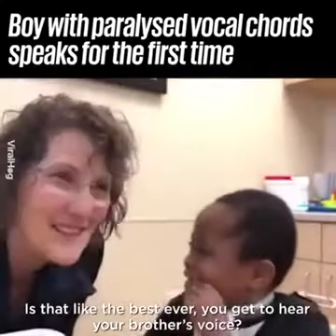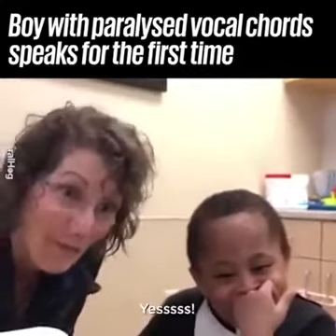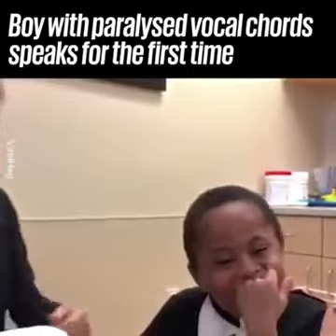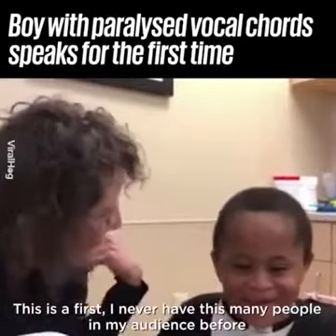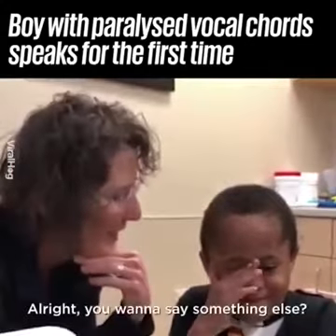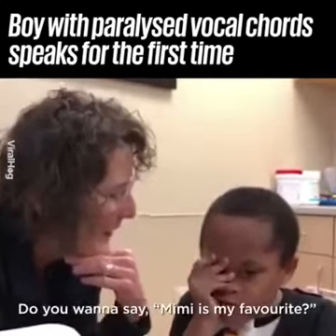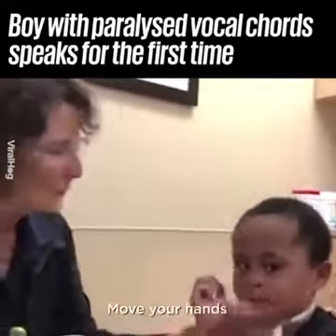What do you think? Is that like the best ever? You get to hear your brother's voice! Is that cool? I've never had this many people as my audience before. Do you want to say something else? Say 'Mimi is my favorite.' Ready? Come on — move your hands.